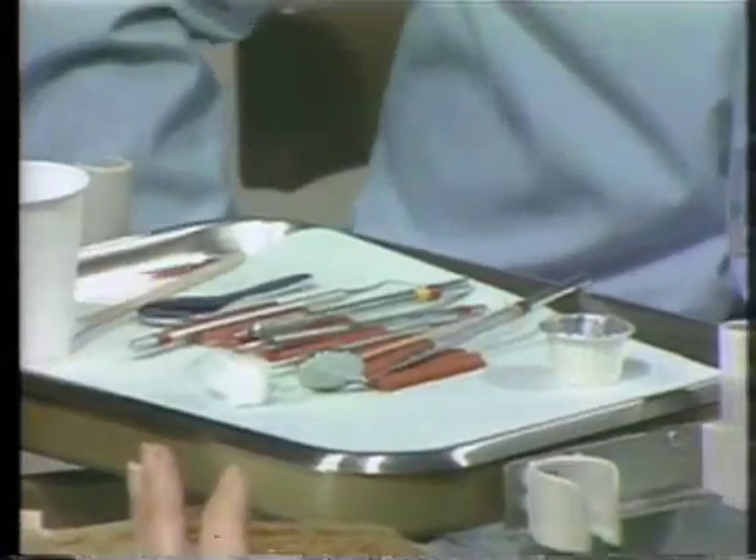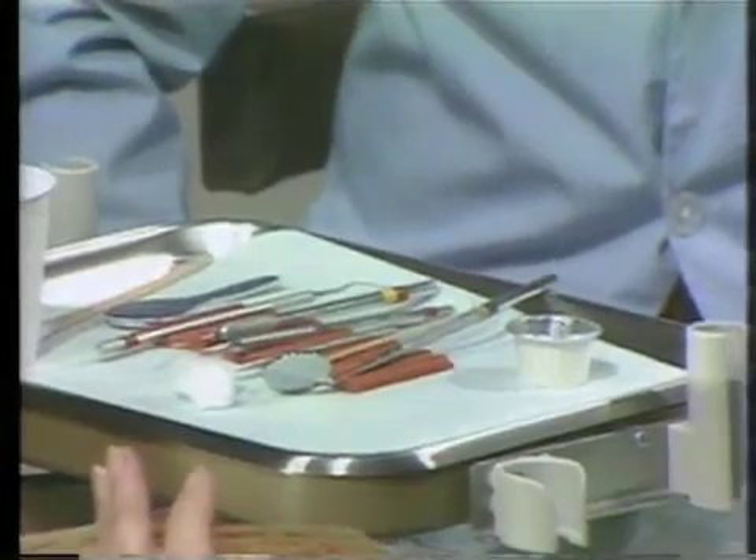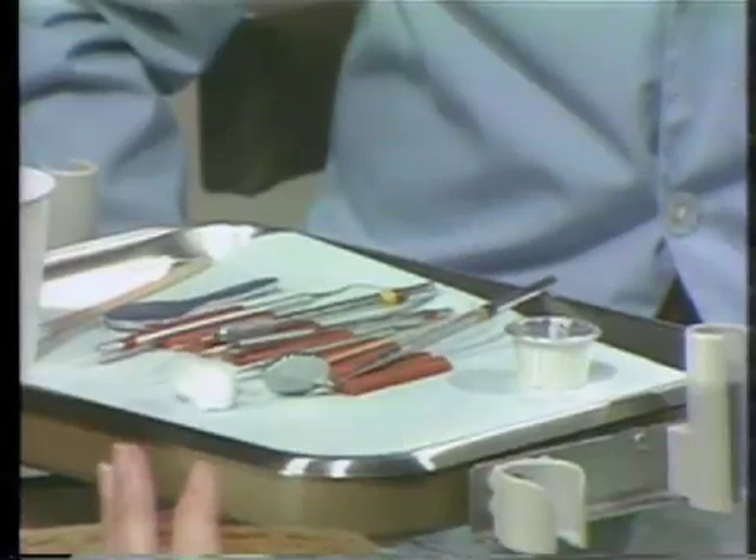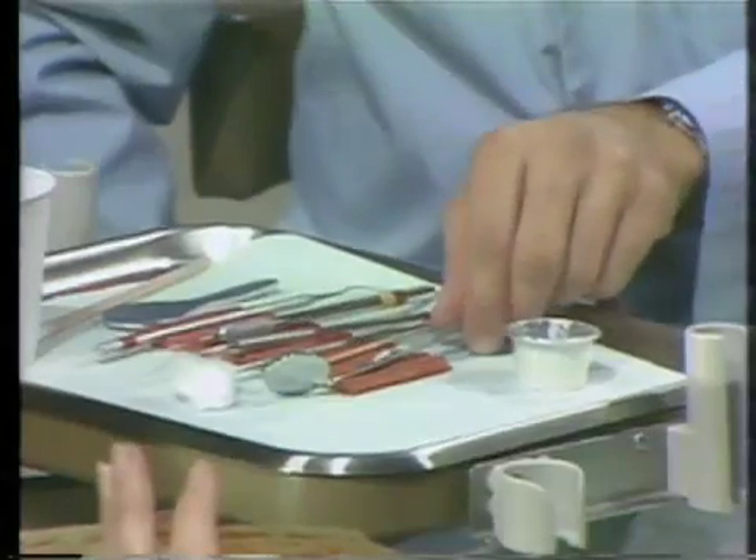Generally, the position that we work from in the clinic is with the patient's head at approximately elbow height. Now let me bring a patient in and explain the recording of the plaque control score to you. I'd like to demonstrate the method for disclosing the patient so that you can visualize the amount of plaque on the surface of the tooth, and also for recording the plaque control scores.